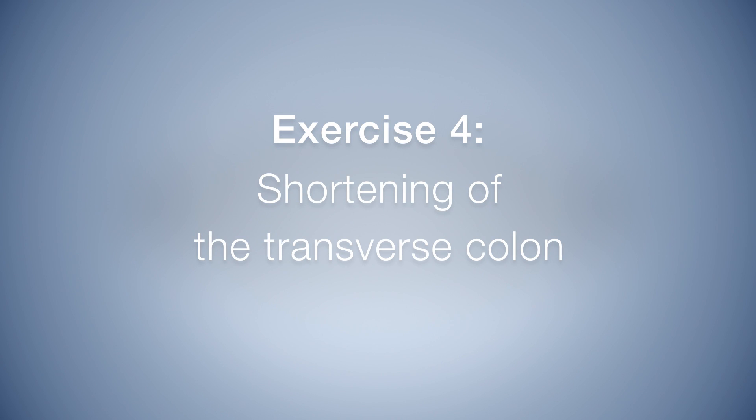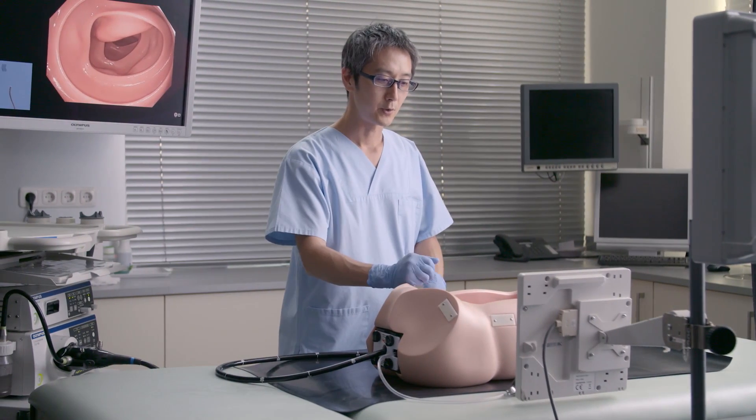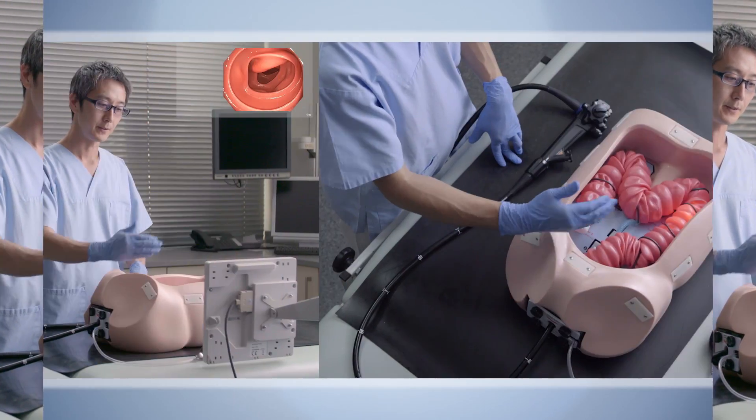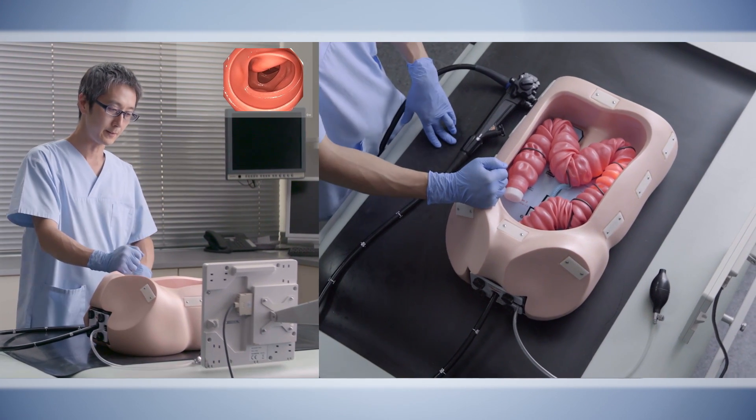Exercise 4: Shortening of the transverse colon. We are now finished with Stage 1 of colonoscopy. We have the sigmoid colon straight, and we have confirmed that it is straight.